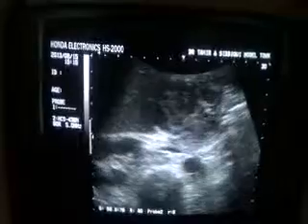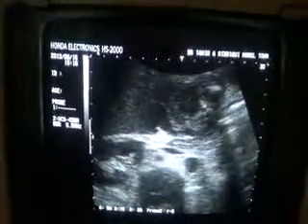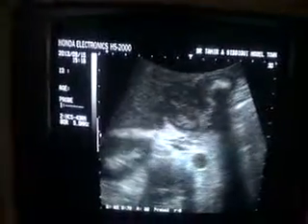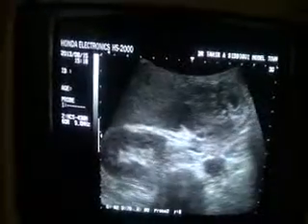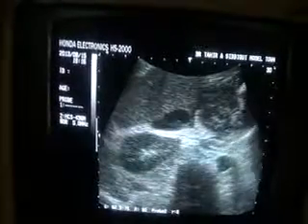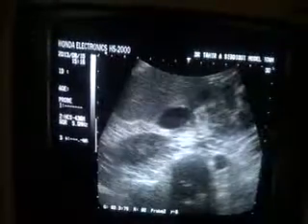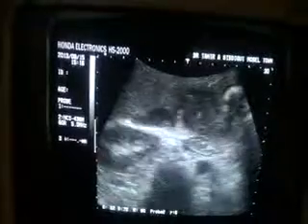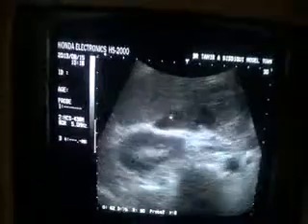So this is in fact a case of acute cholecystitis with perforation and collection of material, that is an abscess with extensions. Now this is a small cystic extension that relates to this abscess or collection, safer word, collection.